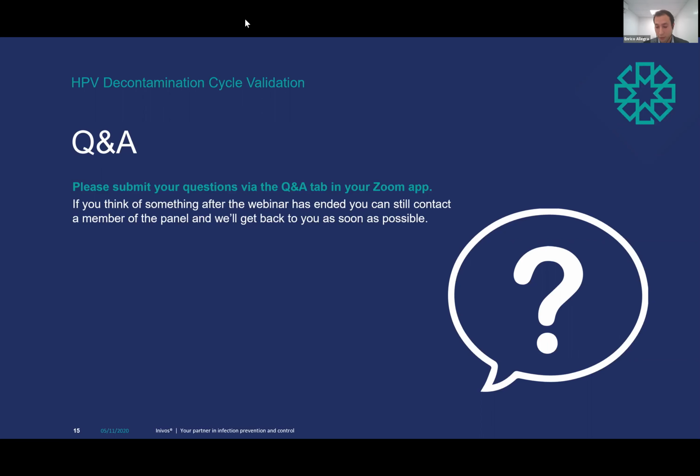And by maintaining that throughout the system, even though you might have loads of absorbent material, your cycle might just be longer, but the system will be able in a way to compensate for that, and therefore you'll still be able to achieve the right efficacy.